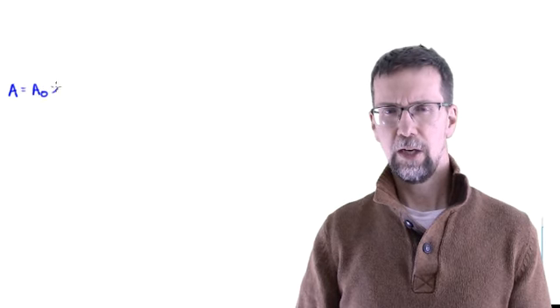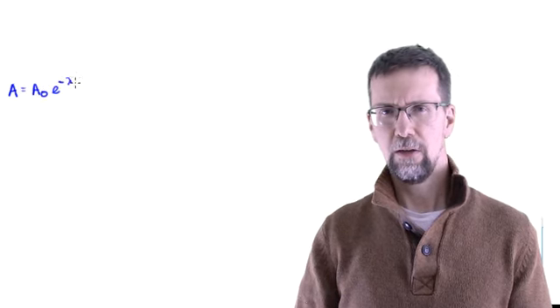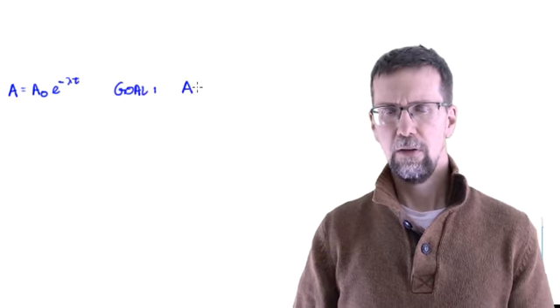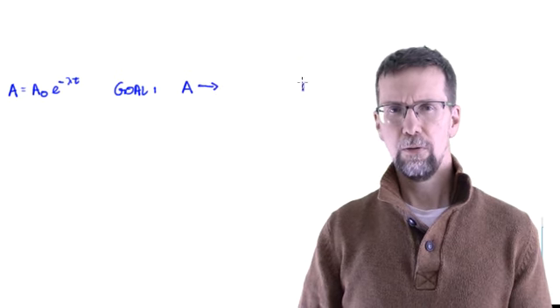In this video, I'm going to introduce the topic of exposure and dose from brachytherapy sources. In the previous videos, you've looked at some common sources that are used, and you've learned the mathematical descriptions of decay, and you know this formula for activity over time. You'll see the exponential decay here.